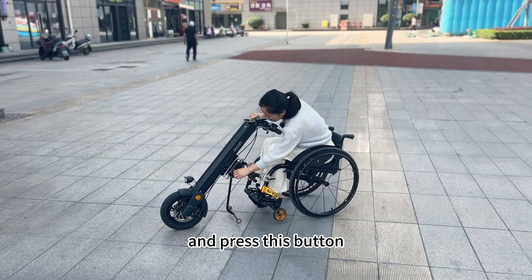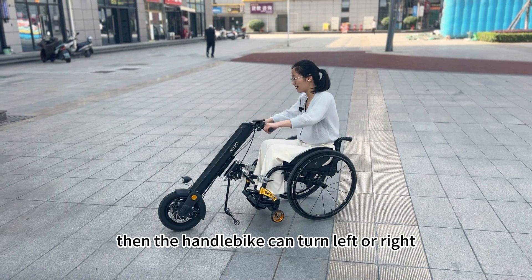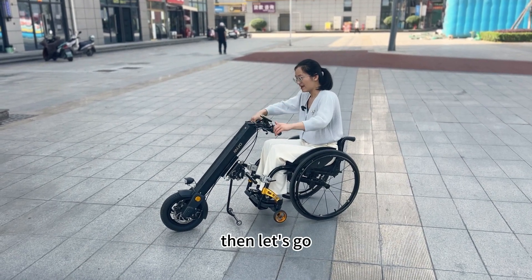And press this button. Then the handlebar can turn left or right. Then let's go!